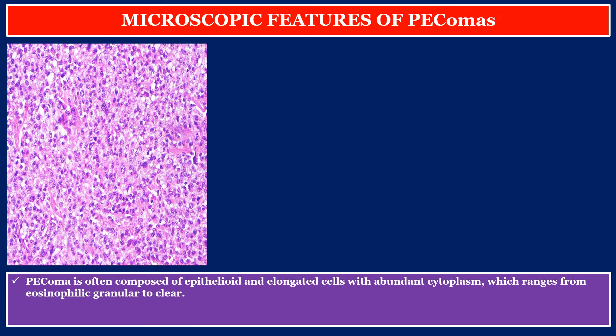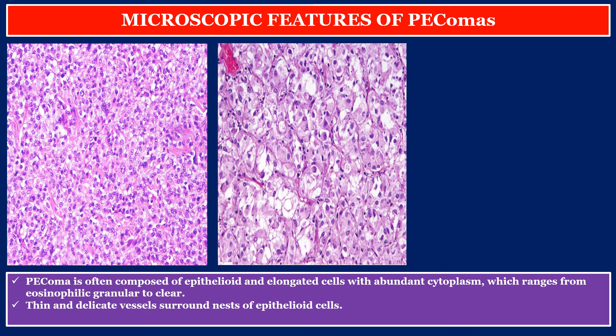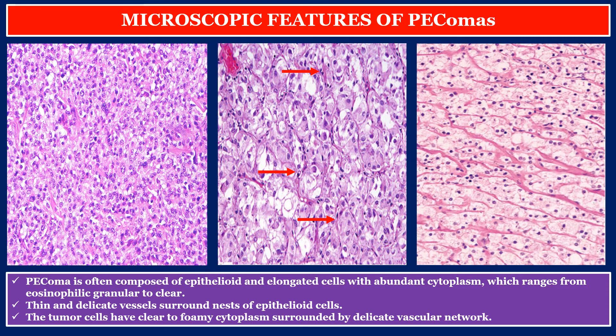High magnification demonstrates relatively monotonous epithelioid cells with granular eosinophilic to clear cytoplasm. Some nuclei have small prominent nucleoli. The PEComa is often composed of epithelioid and elongated cells with abundant cytoplasm ranging from eosinophilic granular to clear. Thin and delicate vessels surround nests of epithelioid cells with eosinophilic to clear cytoplasm.